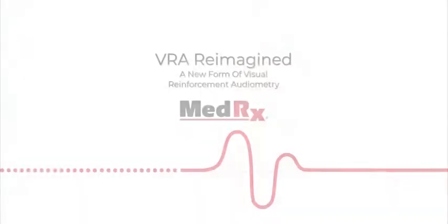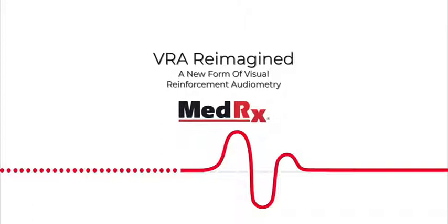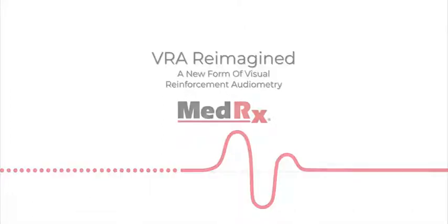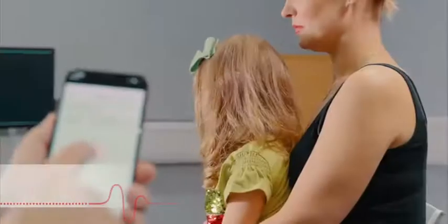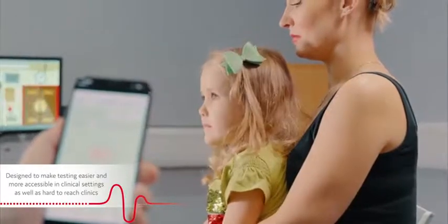The MedRx IVRA, a new approach to visual reinforced audiometry. The MedRx IVRA is an integrated solution designed to make testing easier and more accessible in clinical settings as well as hard-to-reach clinics.